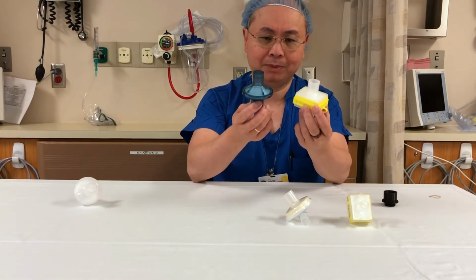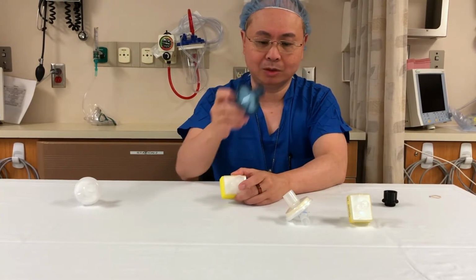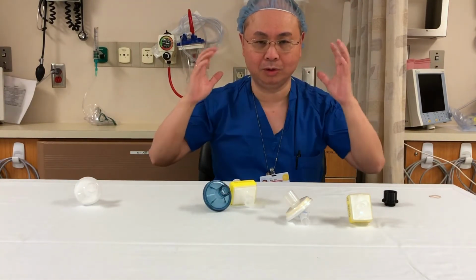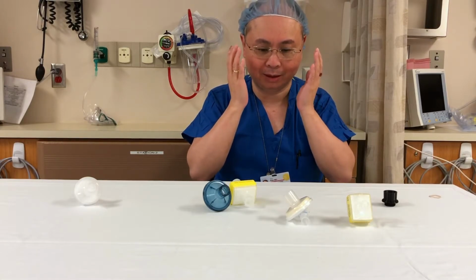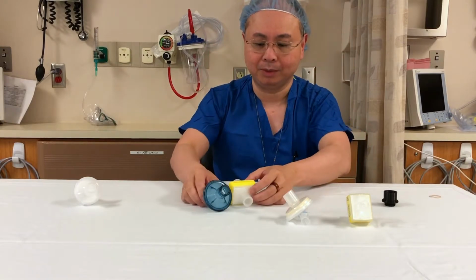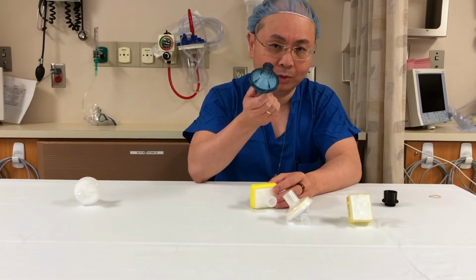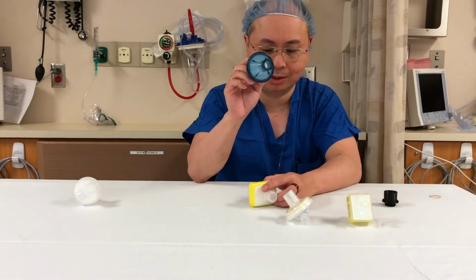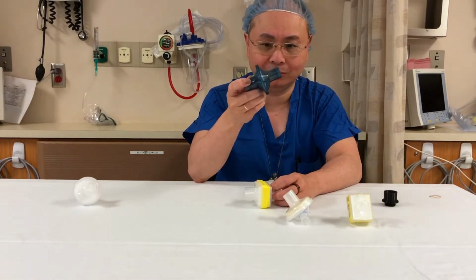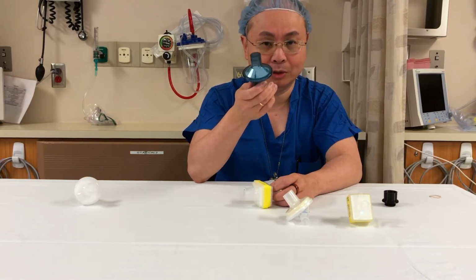And in a Bunny PAPR, it's really desirable to have less resistance in the filter so that you have better intake of air, better clearance of CO2, and the increased flow also allows you to maintain better positive pressure in your bag. So if you have a choice, go for a filter that has lower flow resistance. 1.5 centimeters at 60 liters per minute is fantastic. We don't flow at that rate, so our effective pressure drop is less than that, but that's a good spec to be looking at.